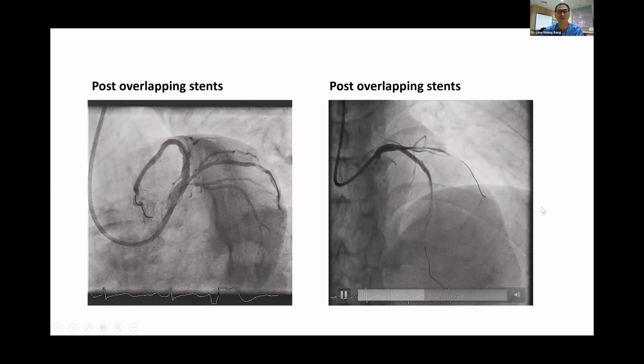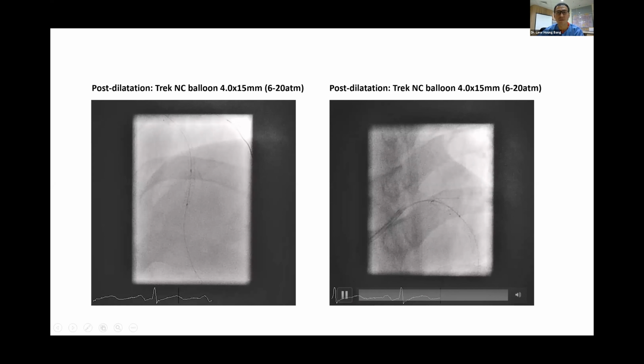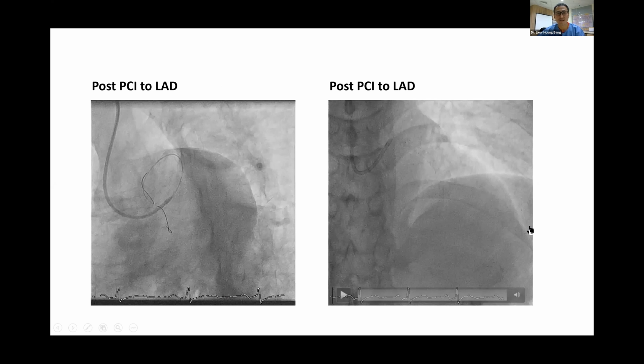Then there's post-dilatation. Post-dilatation in the distal, post-dilatation in the mid-proximal, and up to the ostium. So that's that. Any comment on that? Feel free to criticize. Should we have done more to the circumflex? Should we have protected the diagonal?